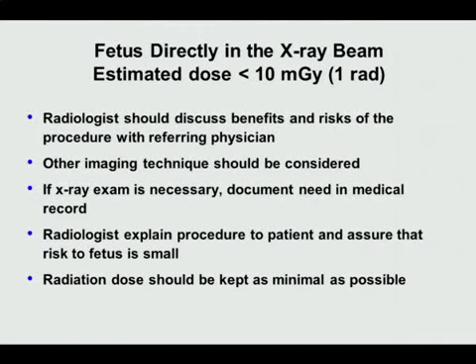And if the X-ray exam is necessary, there should be some type of recommendation document in the medical record. The radiologist explains the procedure to the patient and assures that the risk to the fetus is small, and the radiation dose should be kept as minimal as possible.